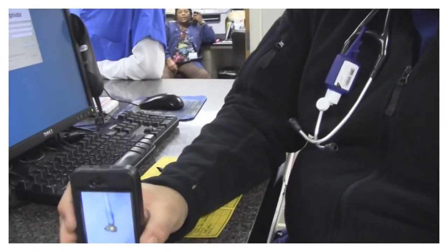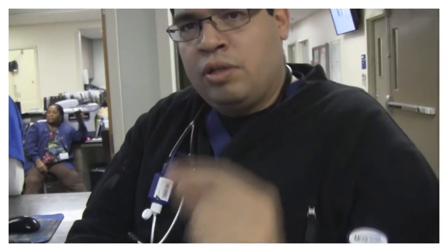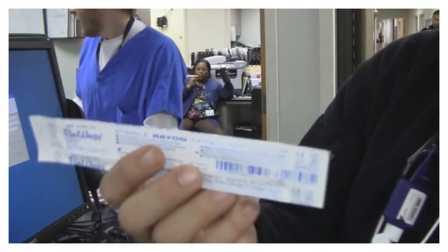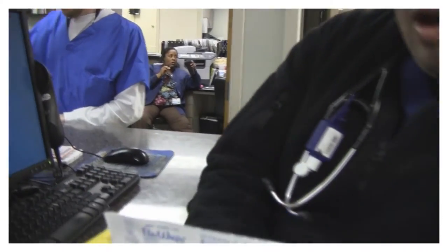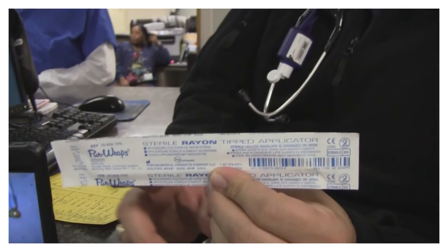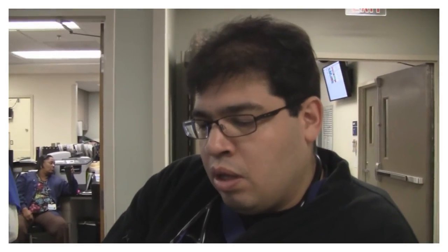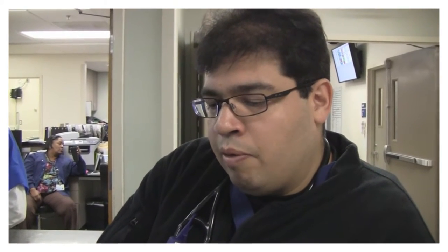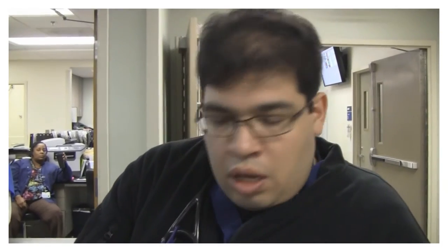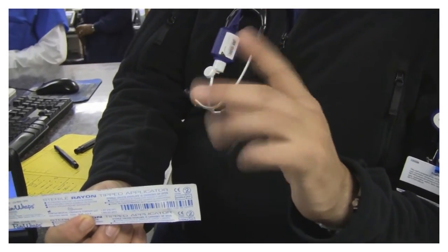But you actually used the Dermabond product? It was the actual brand new Dermabond that comes in the little glass blisters. I used a rayon-tipped plastic swab. I tried first using the free end, but the hollow part had a capillary effect, so it kept sucking the Dermabond in. I really didn't have a lot of Dermabond at the surface available for contact. So then I used the rayon tip and frayed it a little bit so that there were more fibers in a loose configuration.